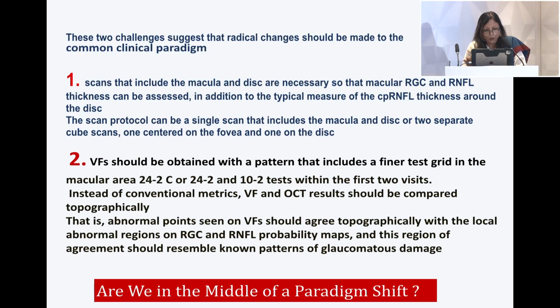So are we actually in the middle of a paradigm shift? We actually could be, as far as these instruments are concerned. But one thing I would like to stress, that you definitely need to see all these instruments along with your clinical acumen. Do not base your diagnosis on any of these instruments without a clinical correlation.